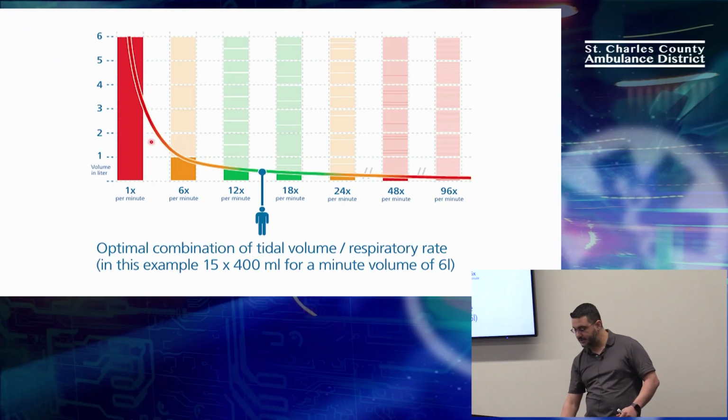But if I'm rocuroniumed, the machine will try to figure out, basically, it runs me across this graph to what it thinks is the least amount of work for me. So it keeps sensing my flows, my pressures, my change on it, me sucking on it. It keeps sensing that and sees how much volume it's delivering, and it tries to do lots of complicated math, and it goes back and forth across this line. This is confusing, right? Okay.